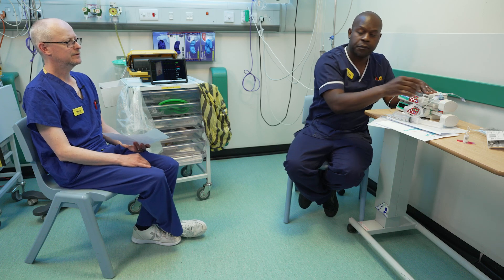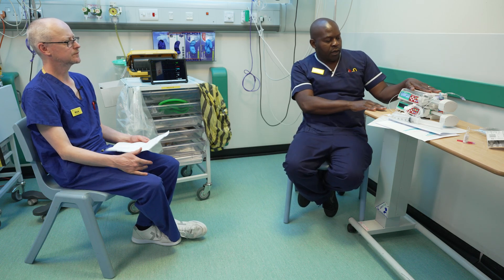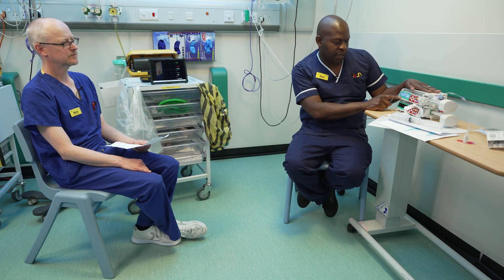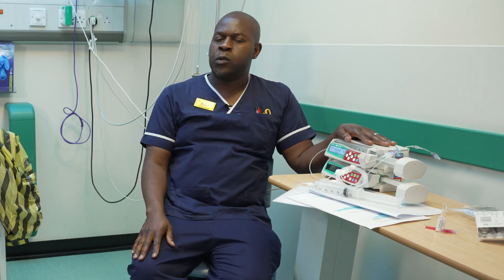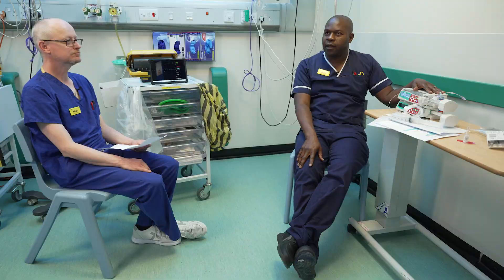How long would you expect one of these syringes to last? It depends on what rate you're running at. At 0.2, that's roughly 10 mils an hour. If you find your patient is requiring a lot of noradrenaline, you can go onto a double strength or quad strength, which helps with less frequent drawing up. I think we've covered everything nicely today. Thank you for listening — I hope it helps you with how to set up the noradrenaline infusion.